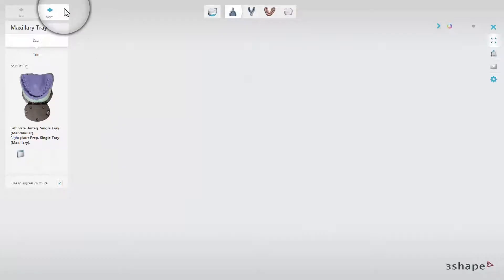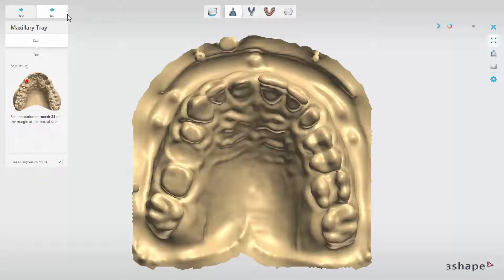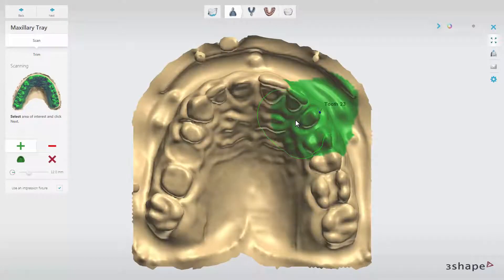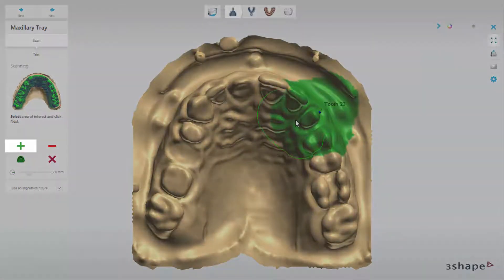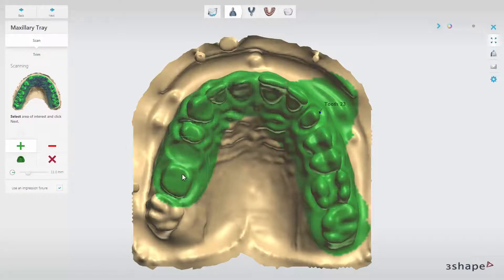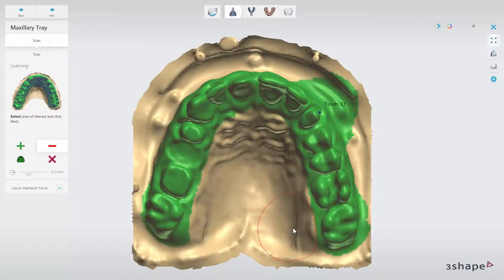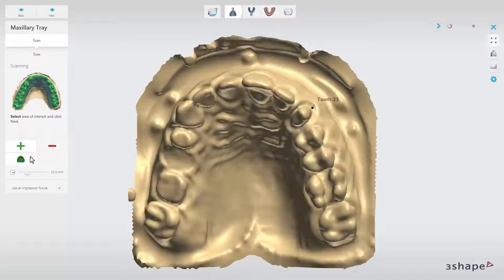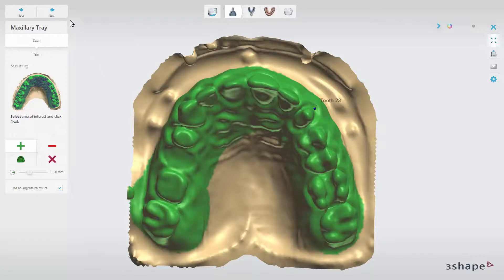Once the impressions are in the scanner, click Next to start scanning. The scanner will first make an initial scan on which you should place annotations. You can select the area of interest to indicate an area for detailed scanning. Make sure that the green plus button is selected to paint over an area of interest. The radius of the tool can be changed using the slider or a combination of the Shift button and mouse scroll. Other available tools will allow you to remove part of a selected area, remove the whole selection, or select the whole area. When you have made your selection, click Next.